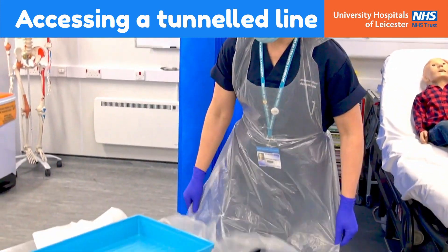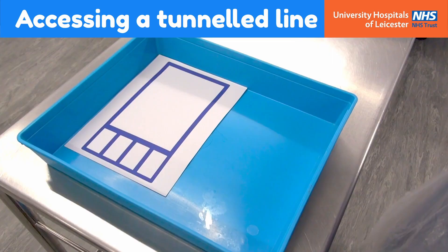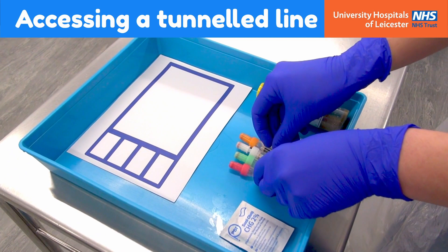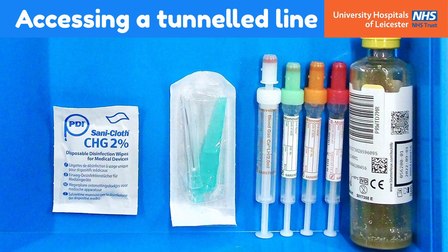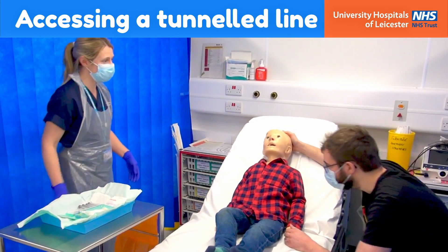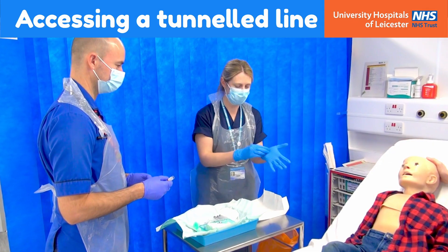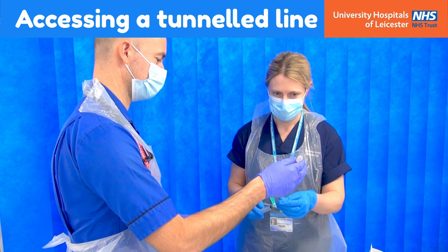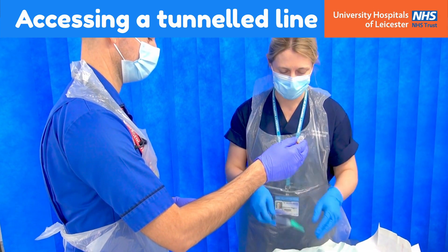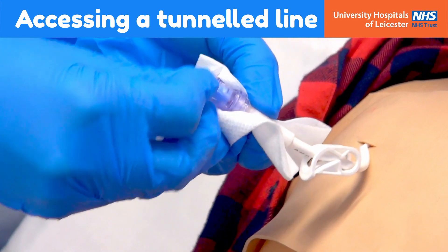Put on gloves and an apron and then clean a trolley and blue tray with Clinell wipes. Open the items into the tray in a sterile manner. If you are planning on taking blood samples, place the blood bottles in a separate tray with the request forms by the bedside; keep another chlorhexidine wipe and a needle in this tray for preparing the blood culture. Position the patient on the bed in a semi-reclining position and expose the area, ensuring the site appears healthy with no signs of infection, dislodgement or injury. Wash your hands and apply sterile gloves. Draw up 10ml of 0.9% sodium chloride and 5ml of heparin sodium 10 units/ml in a sterile manner. Use gauze to hold the line and scrub the hub with the chlorhexidine wipe for 30 seconds, then allow it to dry for 1 minute.